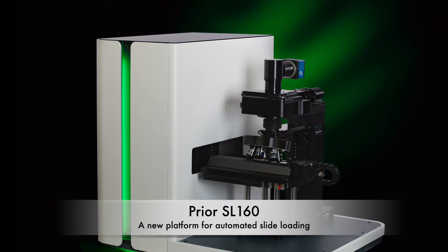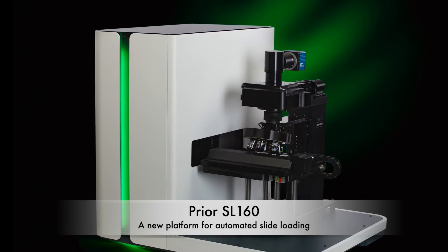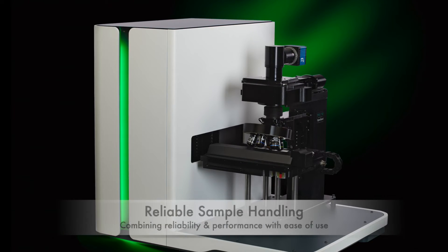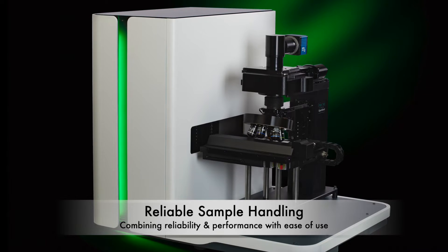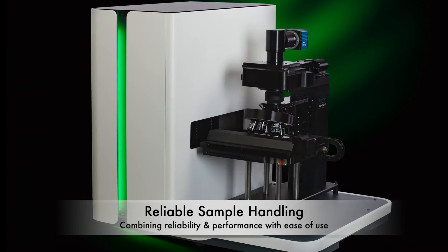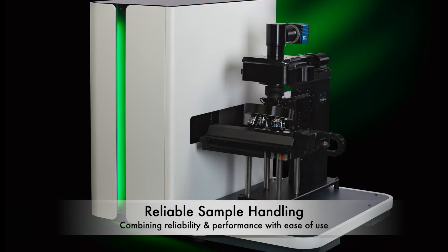The SL160 Slide Loader from Prior Scientific is a fast and easy-to-use system to automate your slide scanning process. The system has been designed from the ground up for robustness and reliability. This next-generation slide loading system has fully integrated sensors and encoders for the ultimate in dependability.